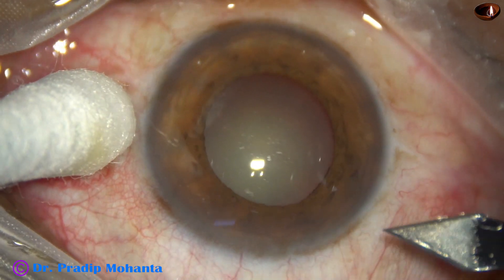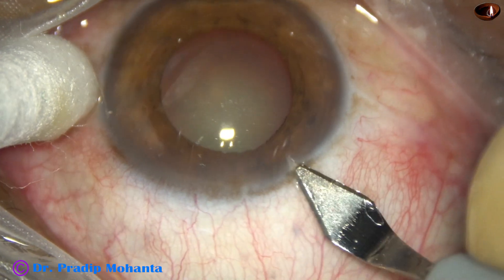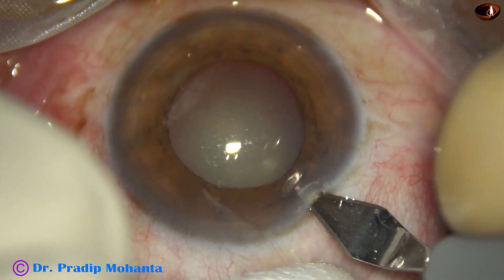In this case, the pupil has dilated to about 4 millimeters. Let us see the surgical steps. This is a totally unedited recording.